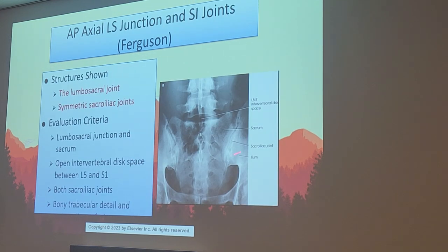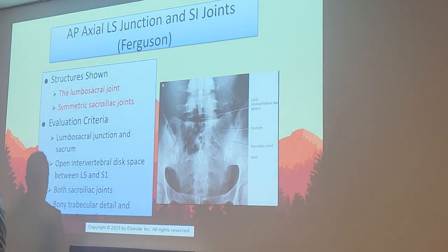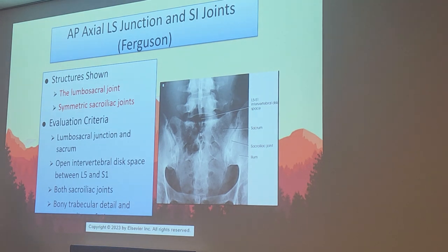All right, now what do we want to see? That beautiful open joint you see right there. Now it shows you an X-ray of what that's going to look like. If you were just doing a regular AP, this would be closed off. We have that nice, beautiful, open L5-S1 joint space visualized on that X-ray. So, of course, what we want to see is the lumbosacral joint, also symmetric sacroiliac joints. We must have the junction of the L5-S1 joint space and both of those SI joints included on the film as well. So once again, this is the AP axial version of that spot film, also called the Ferguson method. Which you know the name of the method as well, the Ferguson method.